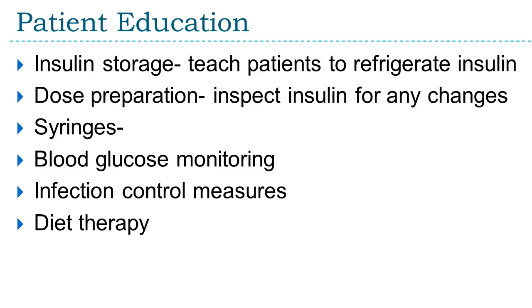because things like hepatitis and some of your bloodborne pathogens can actually live outside those machines, and if you share them with somebody who has some kind of contamination or viruses or something like that, it could spread very, very easily, because those can stay alive for quite a while if they happen to get their own blood on your machine and then you use it and then touch the machine. So it's really not a good idea to share those kinds of machines with anybody.